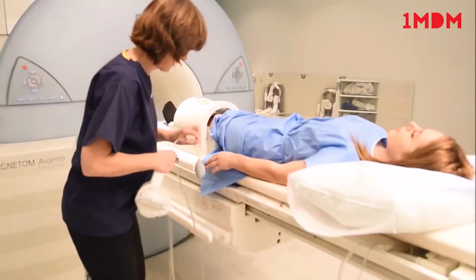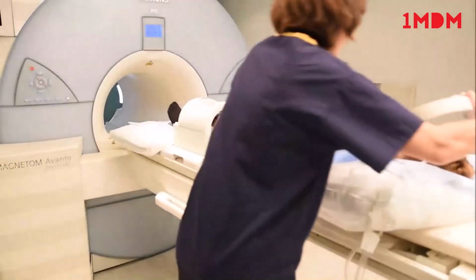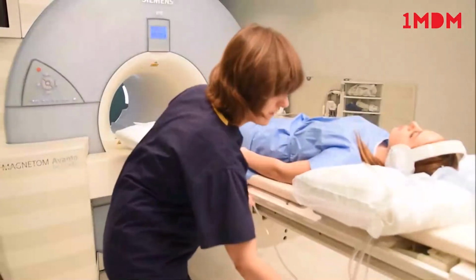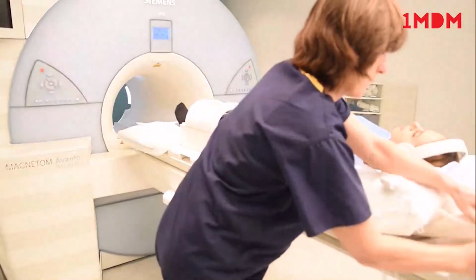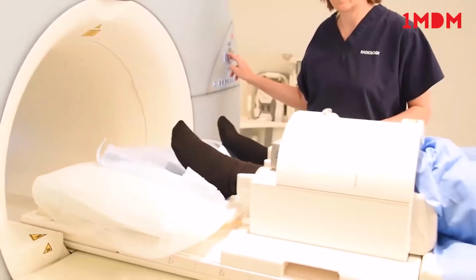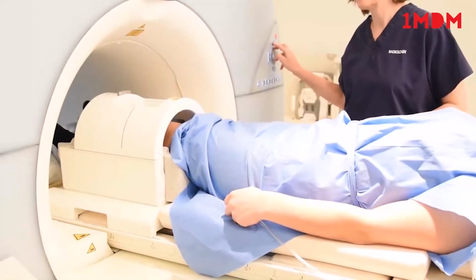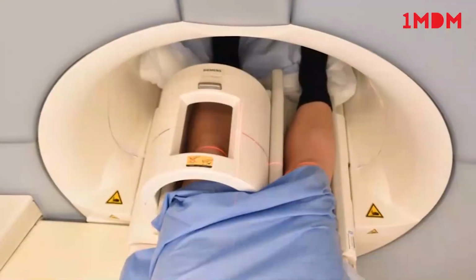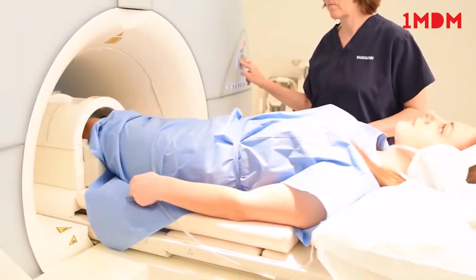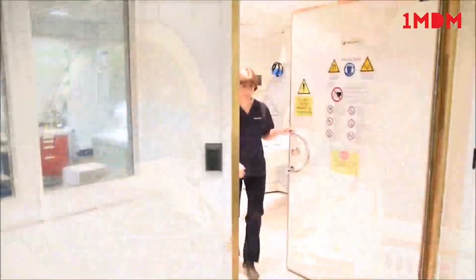Provide the patient with an emergency buzzer. Provide ear protection to reduce scanner noise according to your manufacturer's guidelines. Headphones will also enable communication with the patient during the scan. Move the table and centre the laser beam localizer over the lower border of the patella. Move the patient into the scanner, making sure they're calm and comfortable before you leave the room.